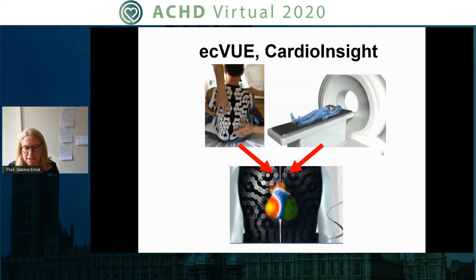The patient then gets a CT scan, and from there we can superimpose all the electrical heartbeats beat by beat on the atrial or ventricular reconstructions and map those non-invasively. Very elegant, and only once we have the arrhythmia documented can we bring the patient to the cath lab.